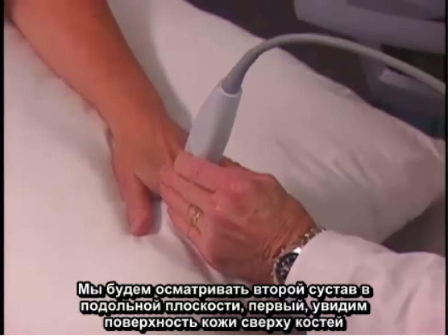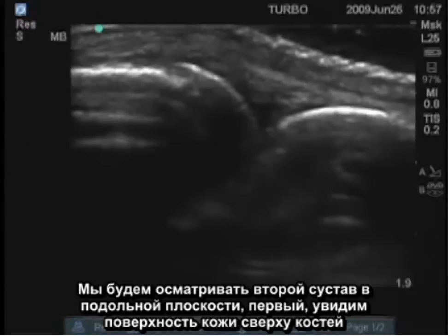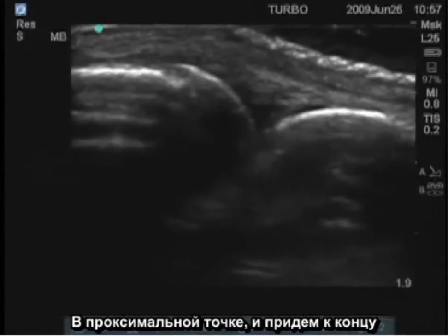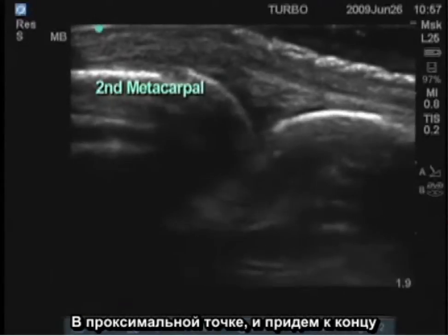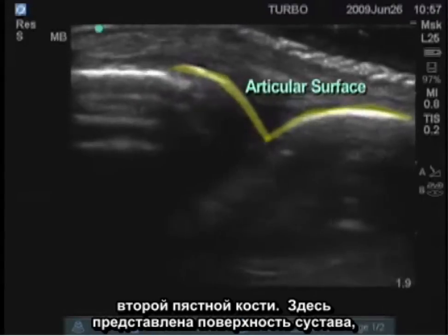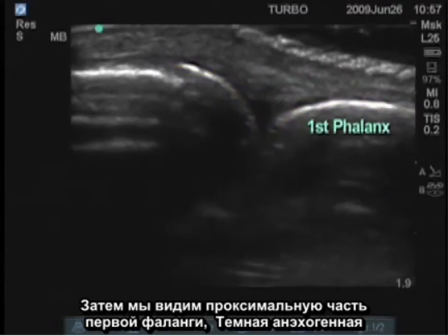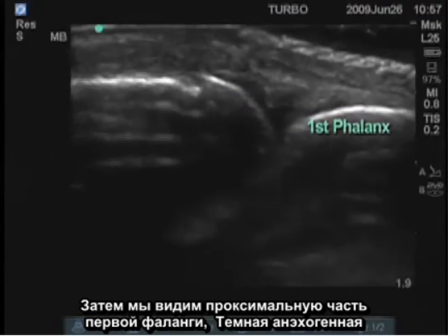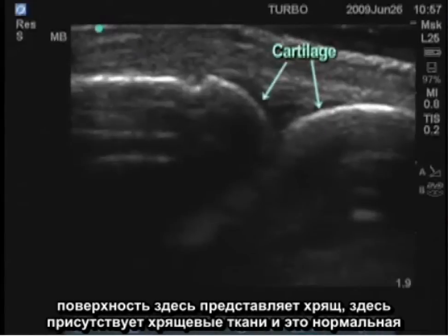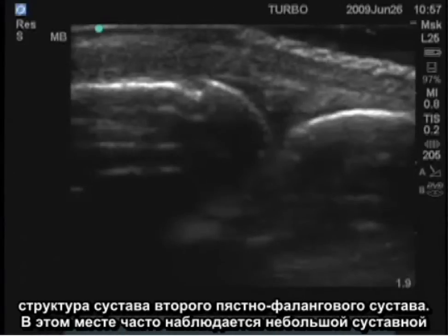We'll look longitudinally over the second MCP first and see the skin surface on the top, the bones — this is proximal, so this is the end of the second metacarpal. Here's the articular surface and then here's the proximal portion of the first phalanx. The black anechoic surface here is cartilage, and there's some cartilage here as well. This is a normal joint structure at the second MCP.